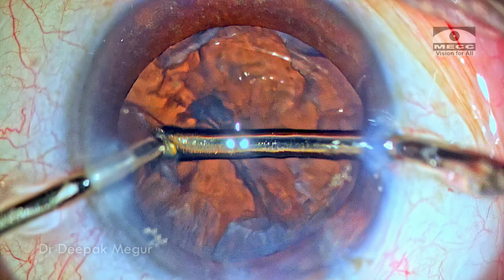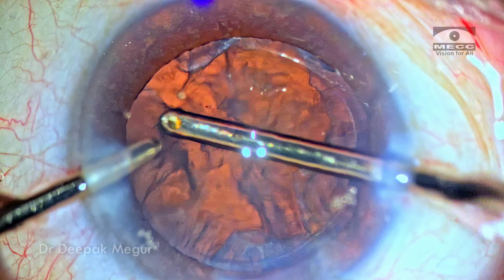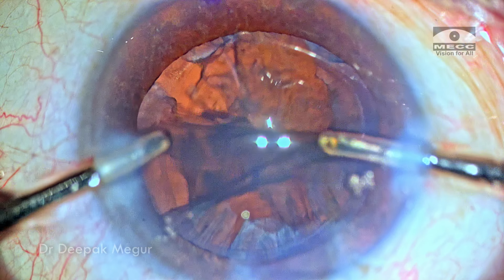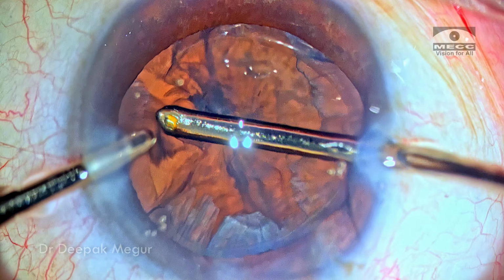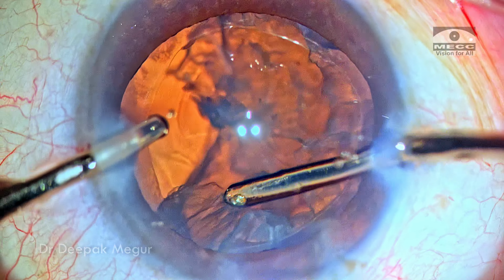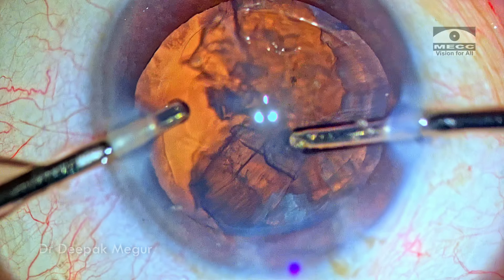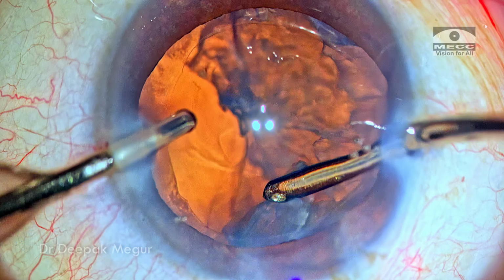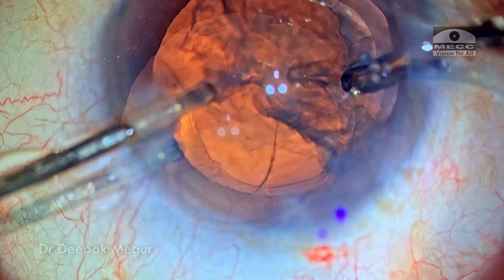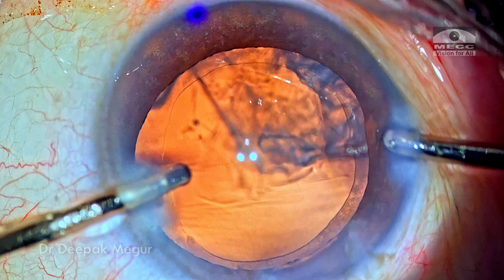Now once it is inside, and once I begin to aspirate and the chamber is evacuated of some of the OVD, then the bottle height is gradually raised to maintain the antechamber. This ensures that the patient does not experience sudden pain. The primary reason for these patients to experience pain is when there is a sudden deepening of the chamber, and the stretching of the ciliary body is what causes them pain.